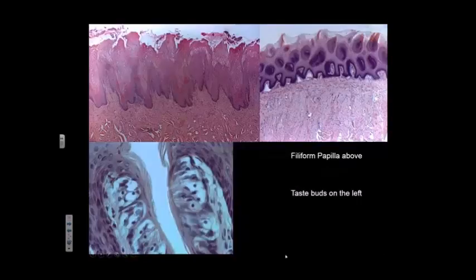Okay, so this is a human tongue. This is an ungulate's tongue. See the keratinization of the filiform papillae. That's why they call them filiform, because they feel kind of filey, like a file. In a cat, a goat, a cow, a horse, they all have real characteristic filiform papillae. Humans don't. They don't get keratinized.